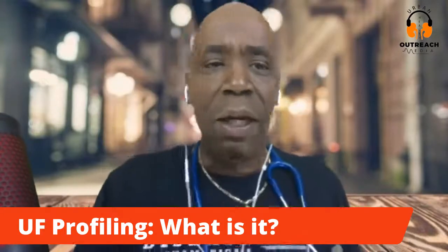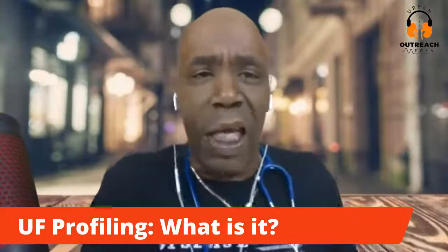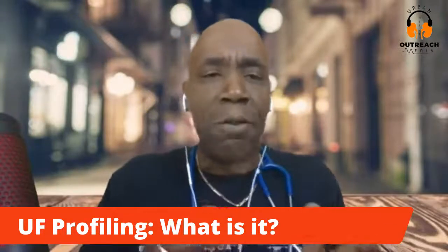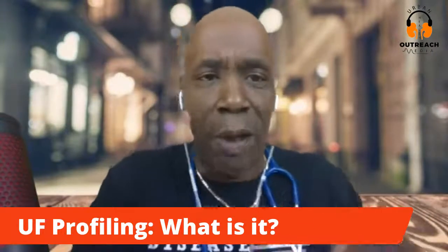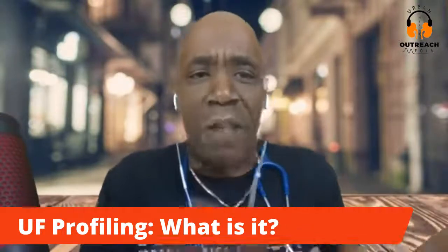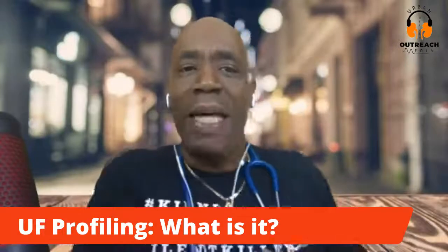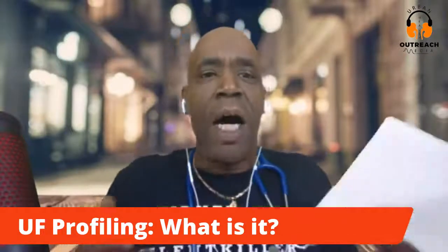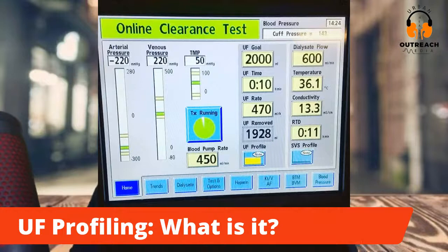With that being said, whatever I say to you about UF profiling, make sure you talk to your nephrologist. Bring it up with them. Don't be afraid to say, hey, doc. Now, if you're having issues with low blood pressure at the end of the treatment, and if you're prone to come in with a little extra fluid, then raise that question with your doctor. If no one ever told you about UF profiling and this is the first time you're hearing about it tonight, then raise that question with your doctor. Say, hey, doc, if the face of my machine looks like this, do you think I can benefit from UF profiling? Yes, be active in your treatment.